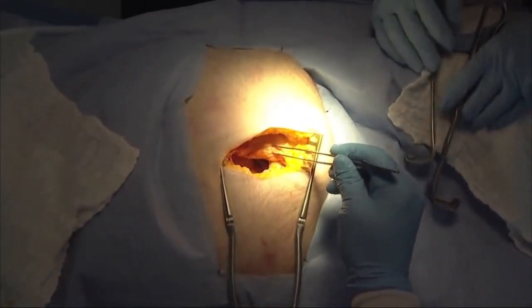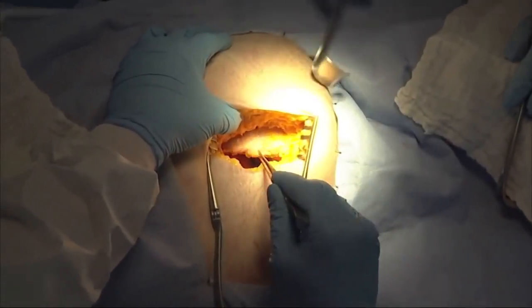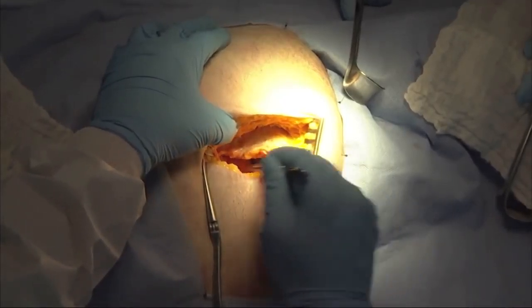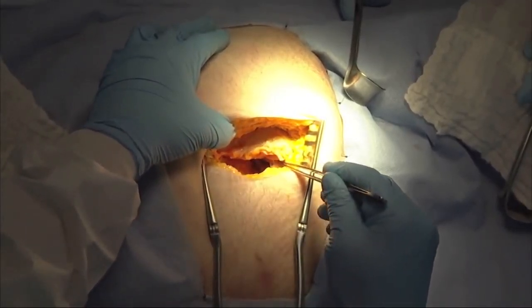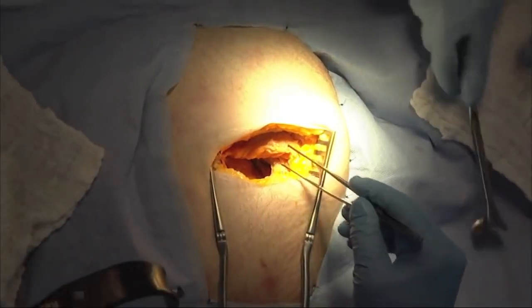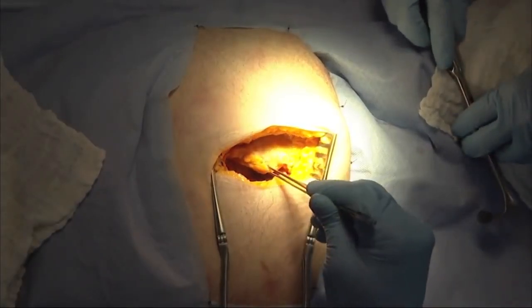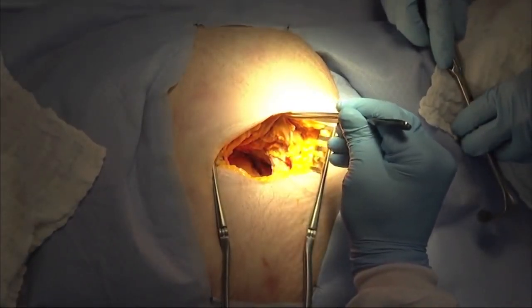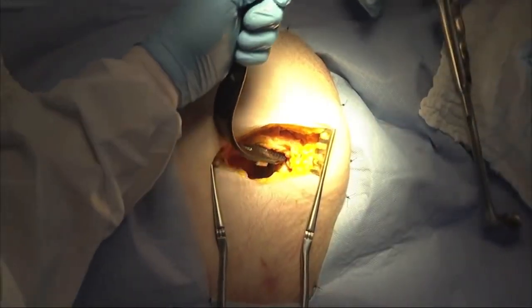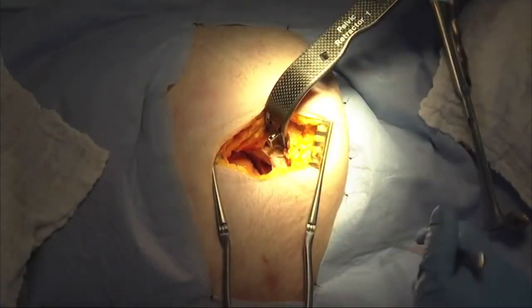So what we've got here is the anterior abdominal wall muscle, or the rectus muscle. Normally what we do is take this and split it right down the midline. Like Mike was saying earlier, in order to be successful in this exposure, we have to take the rectus muscle and really turn it and flip it out of the way so that we can see what we're doing. The first retractor that we're going to use is going to come in here, and we're going to place it just lateral to the pubic tubercle, which is right here.